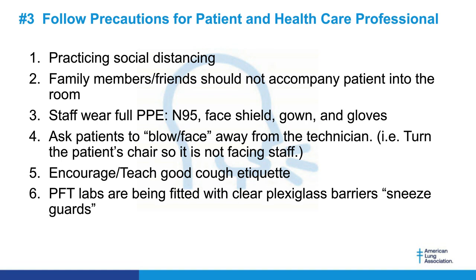In the new world of COVID, we're asking the patients, and I have a slide showing you this in a minute, to blow facing away from the technician doing the test. We actually turn the chair away from us so that it's not facing the staff. In the old days, we used to be in very close proximity to the patient. We had the patient looking at the computer screen, and we were looking at the computer screen, but now we're actually turning the patient away from us. So if they cough, the cough stream goes over.